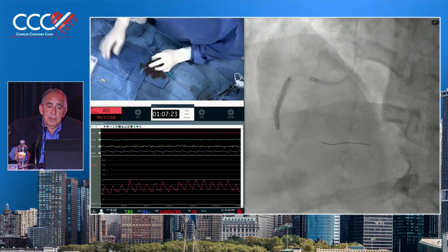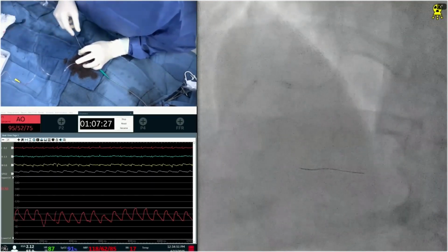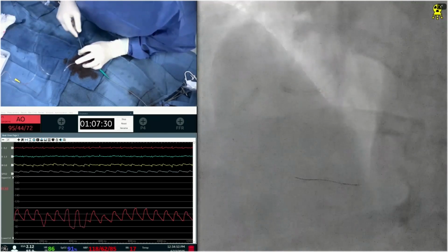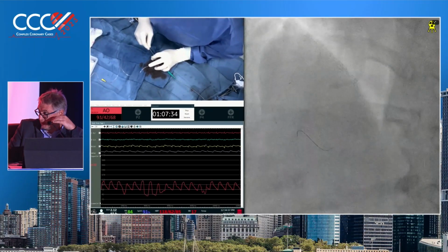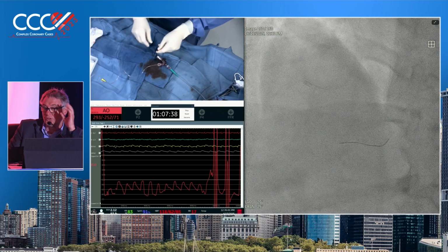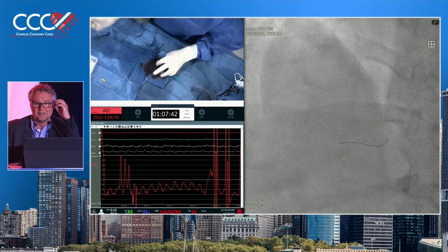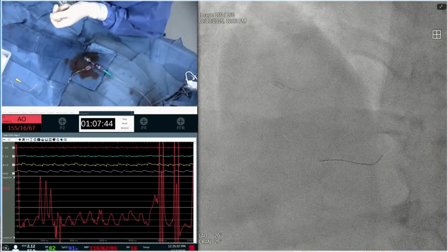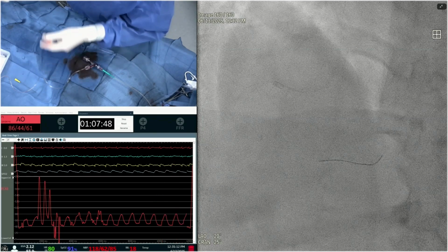Bruno, what are your thoughts here on this case so far? Have you used orbital atherectomy? We do not have it on the shelf in our lab. We thought about taking it in the lab, but we decided to stay with IVL, Rota, and specialty balloons. So no orbital. Arthur? Same. I bet we haven't used it in 6 months.